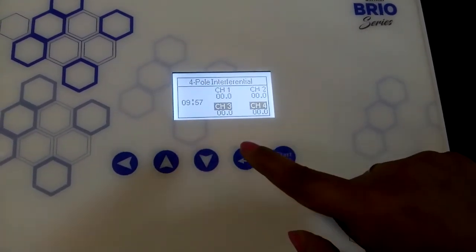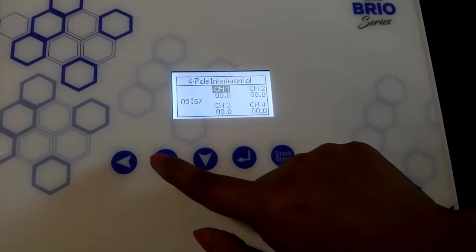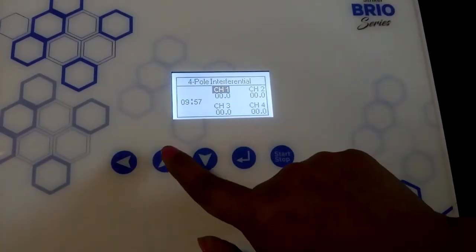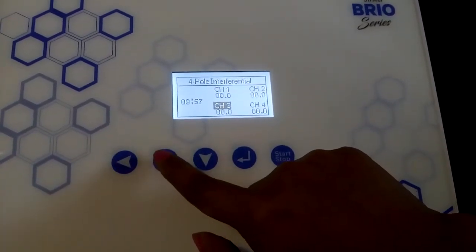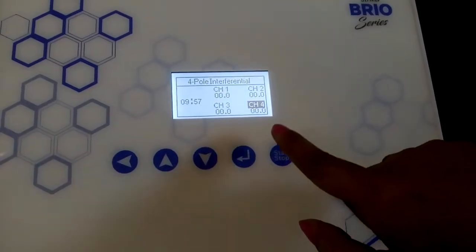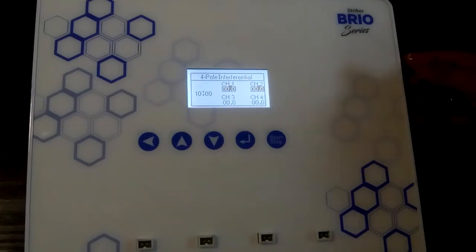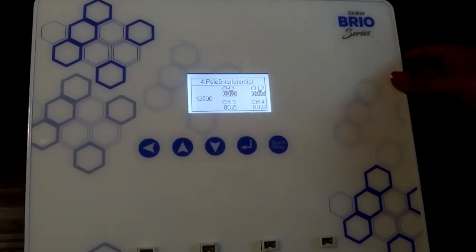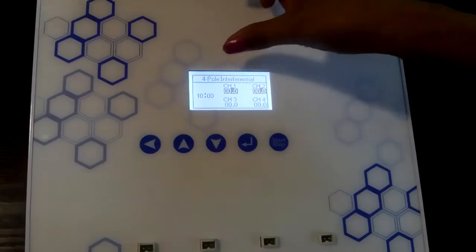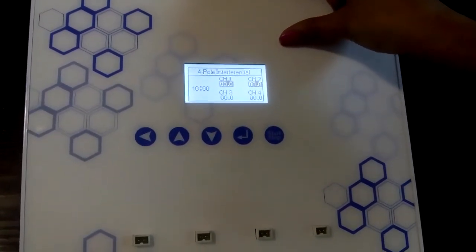If you want to increase an individual channel's intensity, press the channel 1 up button once. Likewise, you can change the intensity by pressing the corresponding channel button. In 4-pole mode, we have seen how to change the intensity of channel 1 and channel 2 together, and how to change the intensity of individual channels.